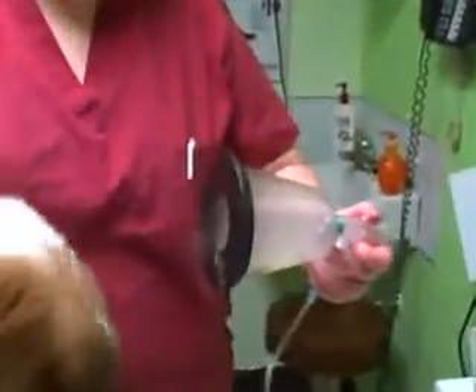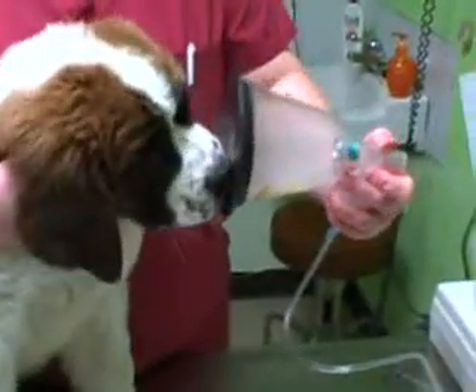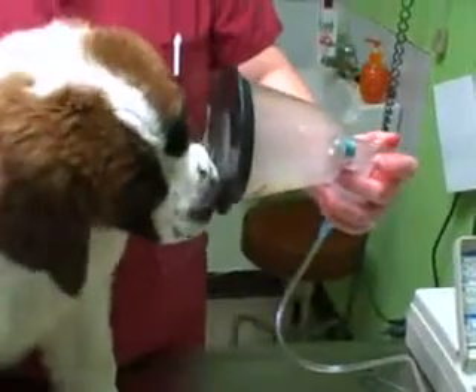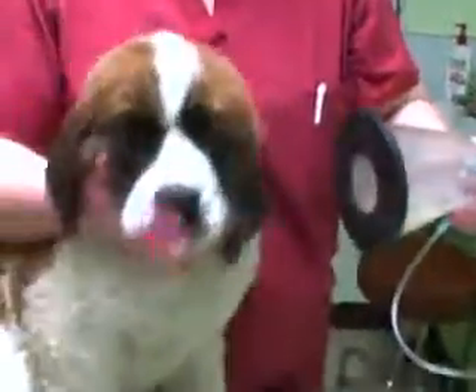If the mask is too large, you can take a rubber jar opener, remove the original diaphragm, tape the edges of the rubber to the mask, and make an X in the center so that it will fit your dog better.